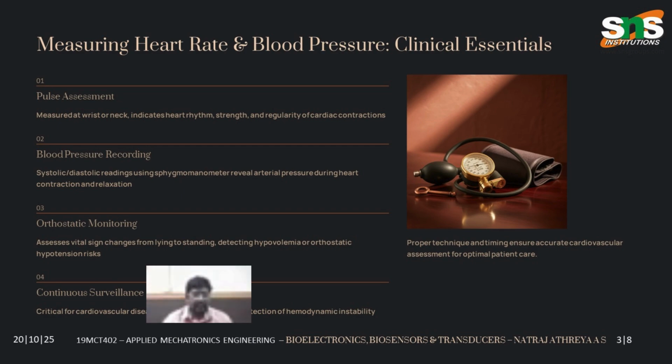Then we have continuous surveillance. It is critical to identify cardiovascular disease management, and it is very important to identify it early so that it does not deteriorate over time. We also have to identify hemodynamic instability, as in the dynamic variations of our blood pressure and so on.